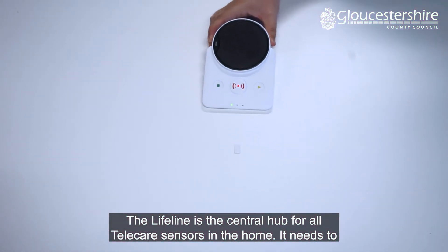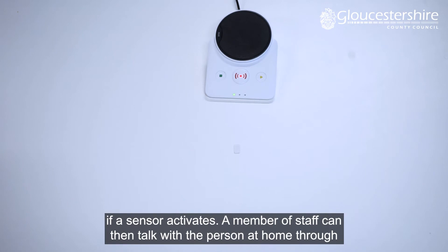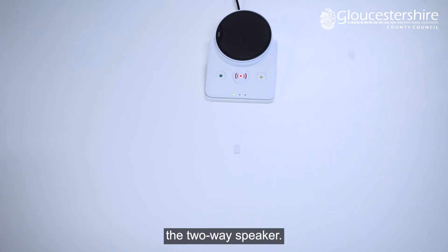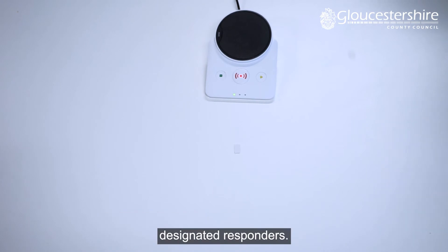The Lifeline is the central hub for all telecare sensors in the home. It needs to connect to a working phone line and uses this to raise an alarm with the monitoring centre if a sensor activates. A member of staff can then talk with the person at home through the two-way speaker. If the monitoring centre has concerns or they can't get a response, they will contact one of the designated responders.